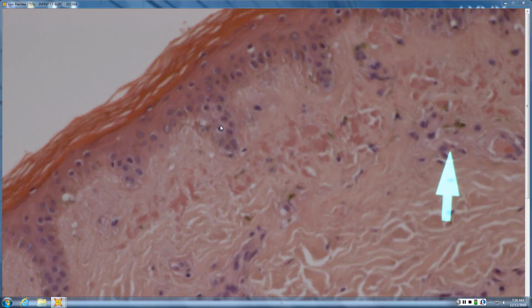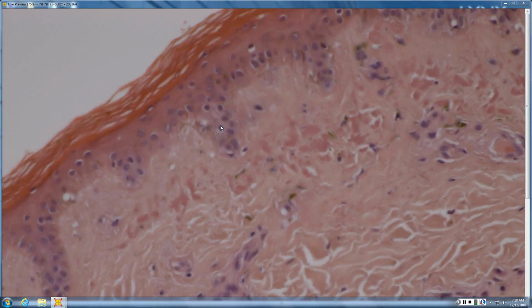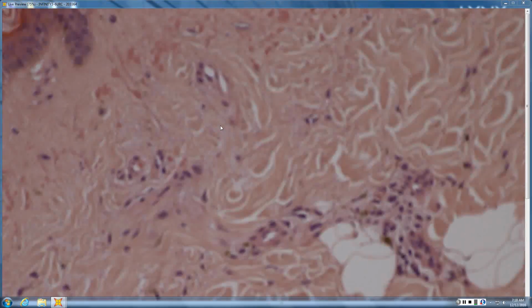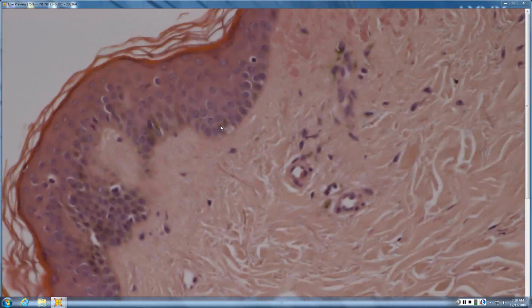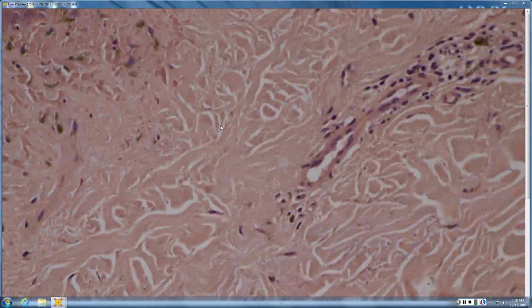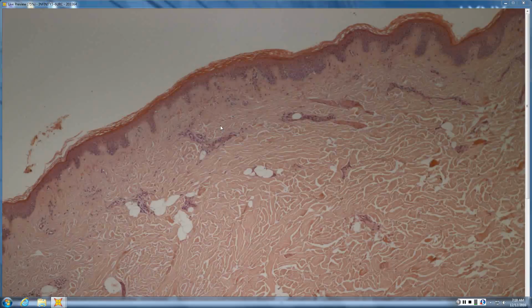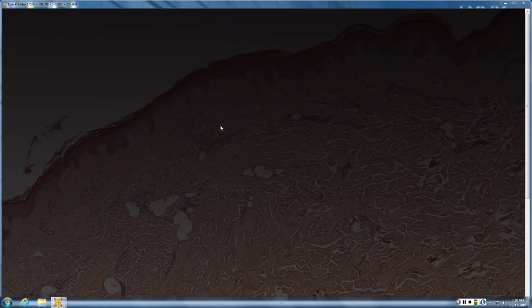So the other thing that might catch your eye is all the pigment incontinence, right? When you start seeing pigment incontinence, it means that you should probably go look up in the papillary dermis and the epidermis a little more closely. So that would be your hint here. Okay? And the type of amyloid for this one? Keratin derived. So it doesn't really mean anything as far as systemic.